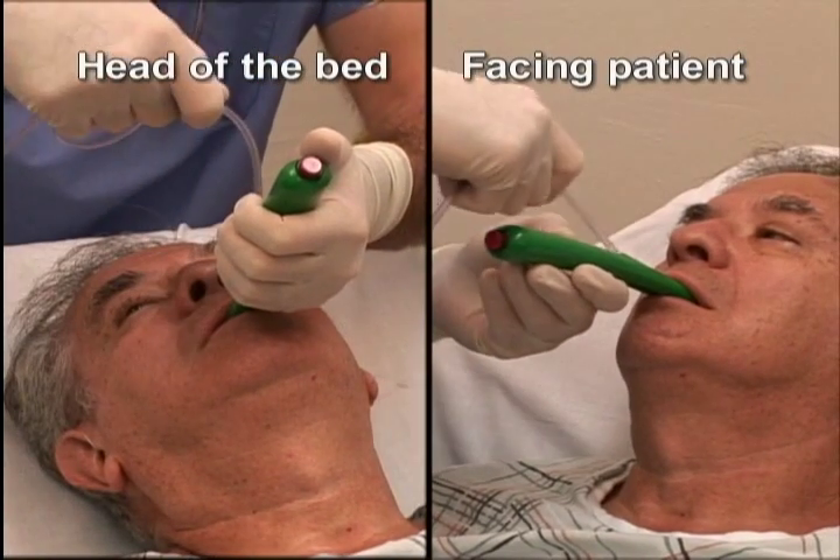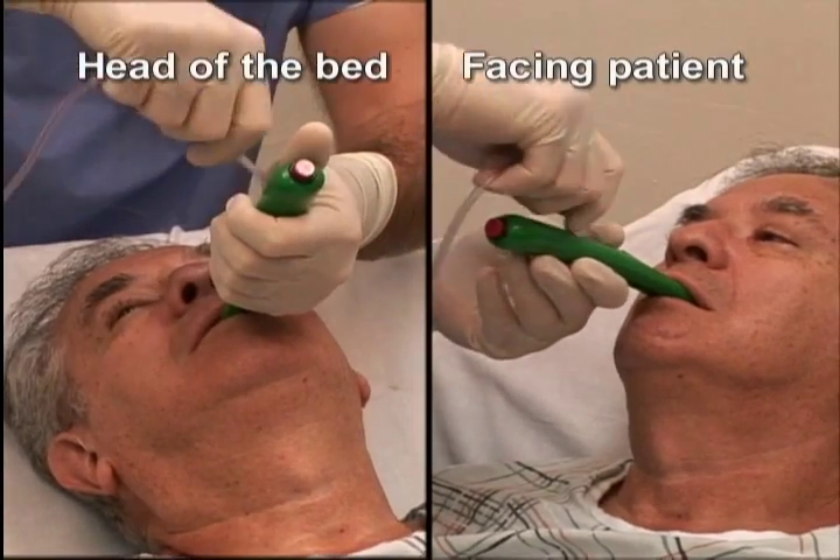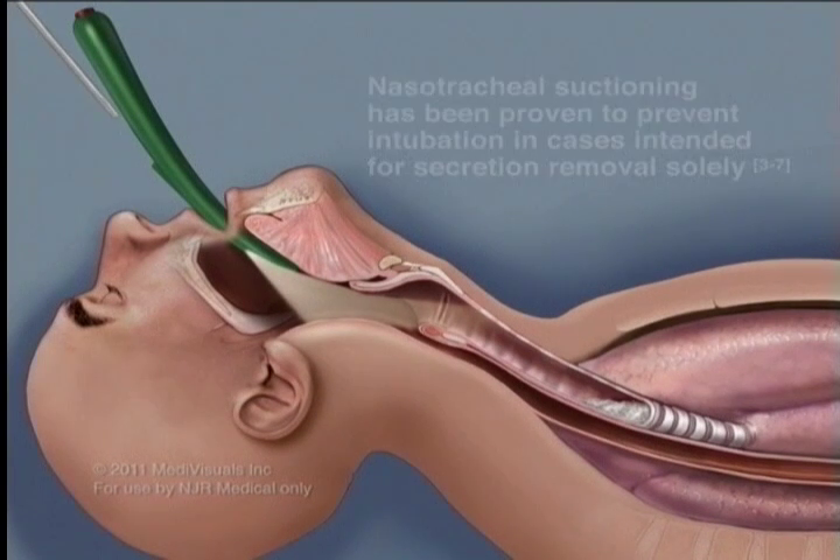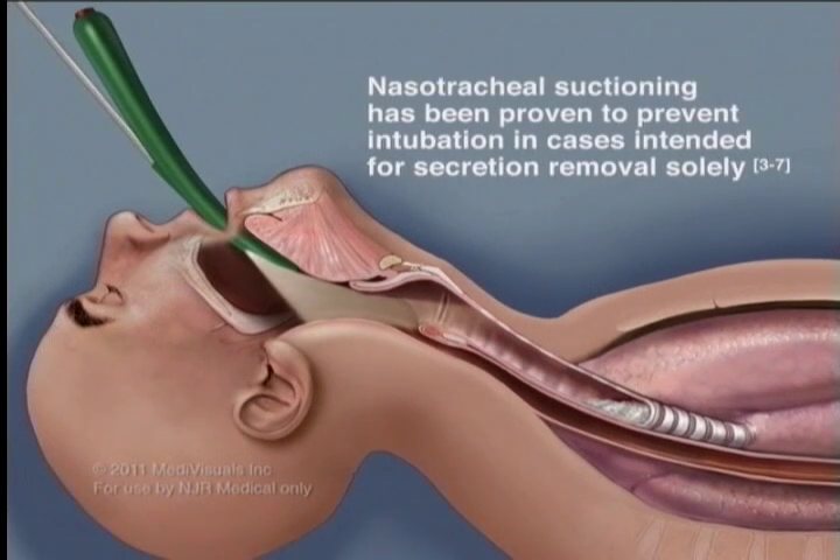Insert the No-Bite 5 into the patient's mouth. Depress the tongue to facilitate opening of the airway. Turn on the light. Insert the tracheal suction catheter into the guide until the desired depth of the trachea is reached and then suction out secretions.